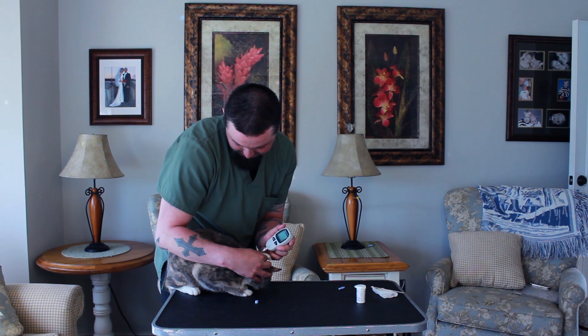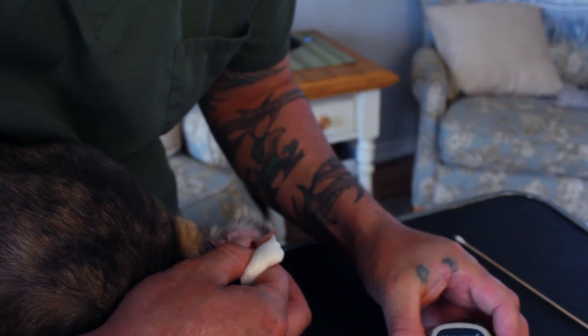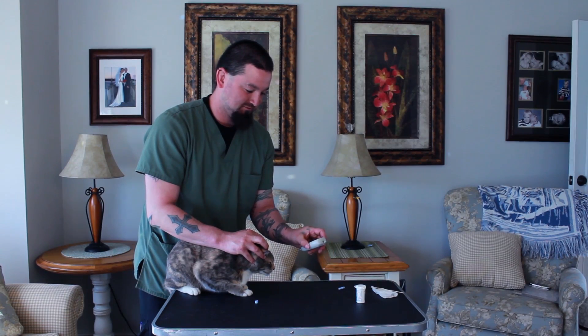And I'm going to apply it. It's taking a reading now — 95.